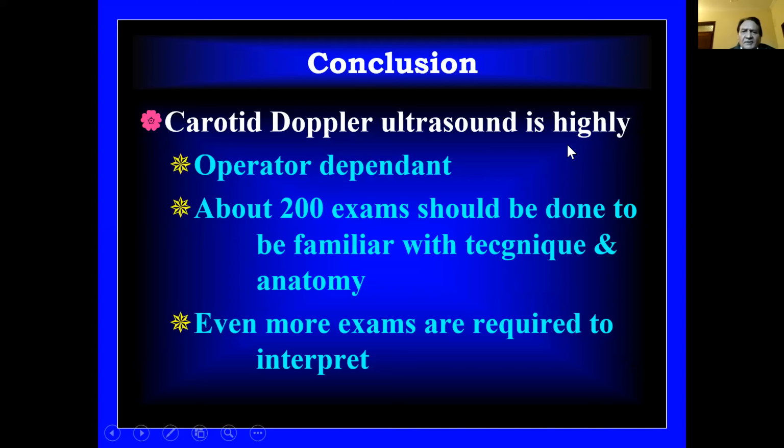Conclusion: the carotid Doppler ultrasound is highly accurate, but it is operator dependent. About 200 exams should be done to be familiar with technique and anatomy. Even more exams are required to interpret. Thank you very much.